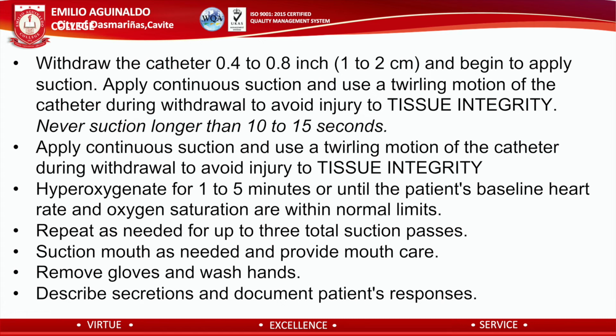Apply continuous suction and use a twirling motion of the catheter during withdrawal to avoid injury to tissue integrity. Never suction longer than 10 to 15 seconds. Loss of tissue integrity by trauma results from frequent suctioning, prolonged suctioning, excessive suctioning pressure, and non-rotation of the catheter.